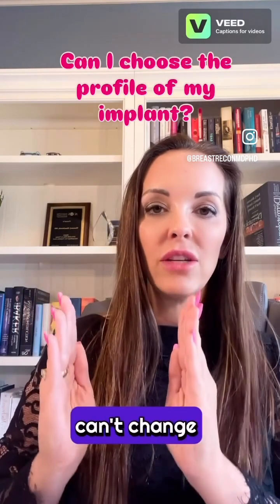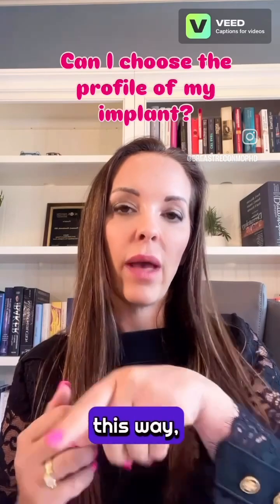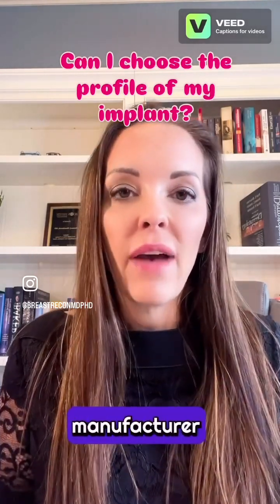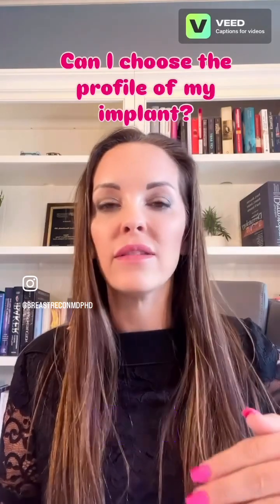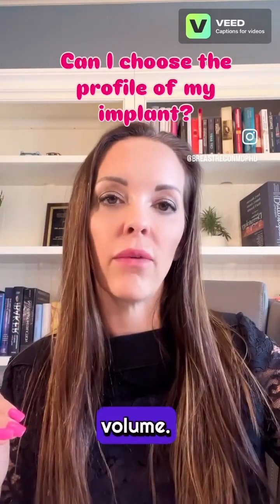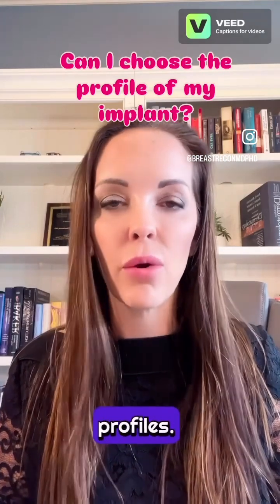And if we can't change the width, the only way to get more volume is this way, volume or projection. Now, an implant manufacturer could have just had a running list of all of the different widths and possible cc's or volume, but instead they broke it up into these confusing different types of profiles.